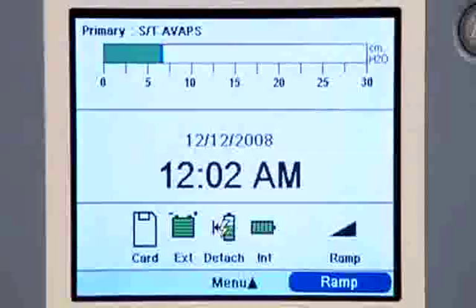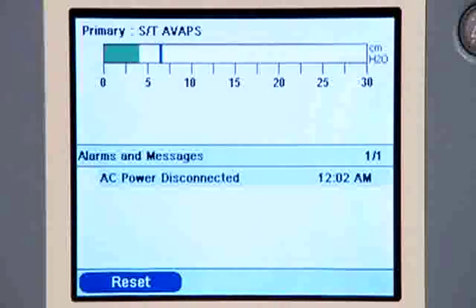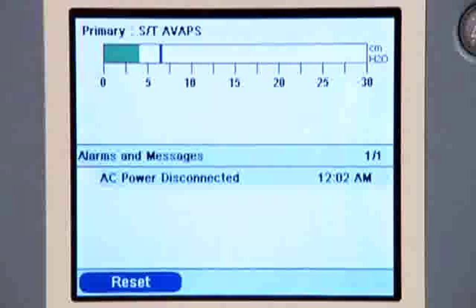Trilogy also displays informational messages and confirmation alerts that notify you of conditions requiring attention — for example, the AC power cord is unplugged or the battery is no longer charging. You will hear a single beep when an informational message appears. Trilogy 100 has a variety of messages and alarms; you can find more information on specific messages and recommended responses in your manual. Keep the manual readily available when the ventilator is in use. If you are unable to correct a problem, contact your home care provider. If at any time the patient has difficulty breathing, call for emergency medical assistance.